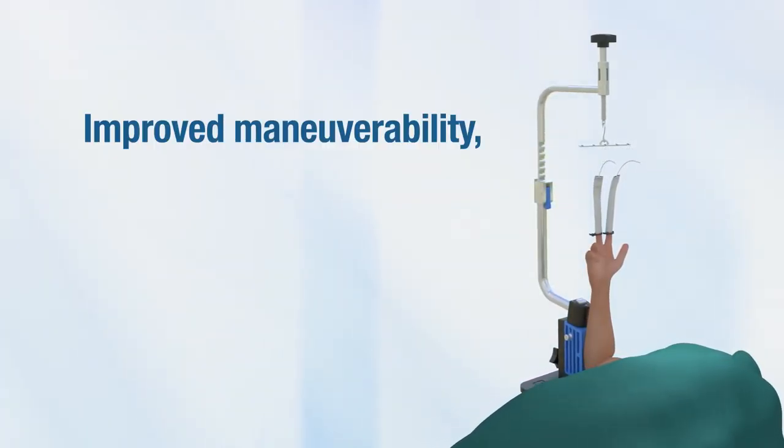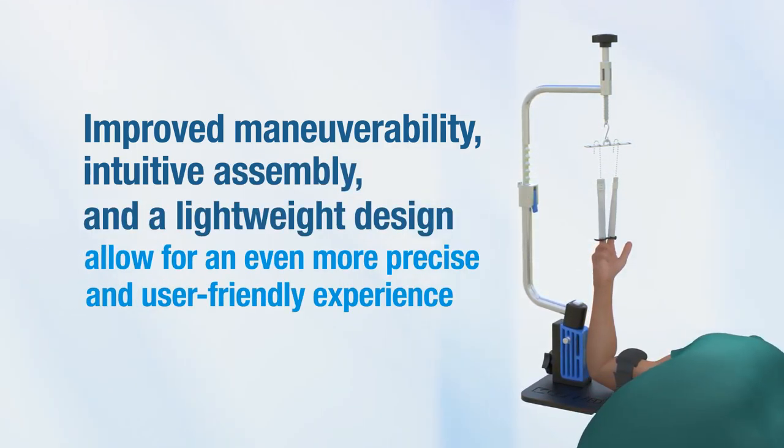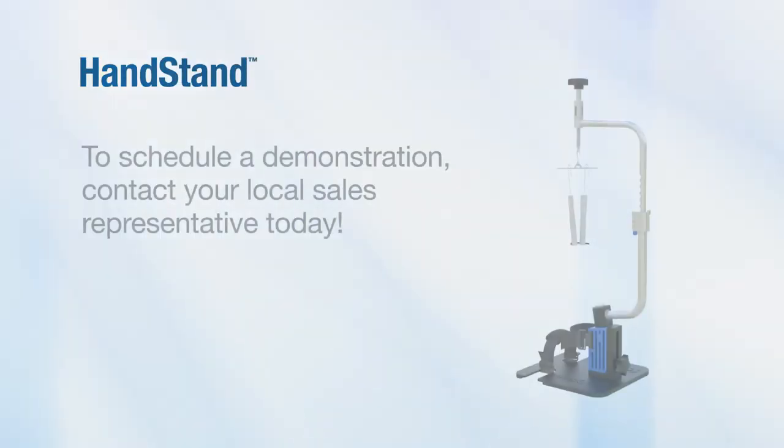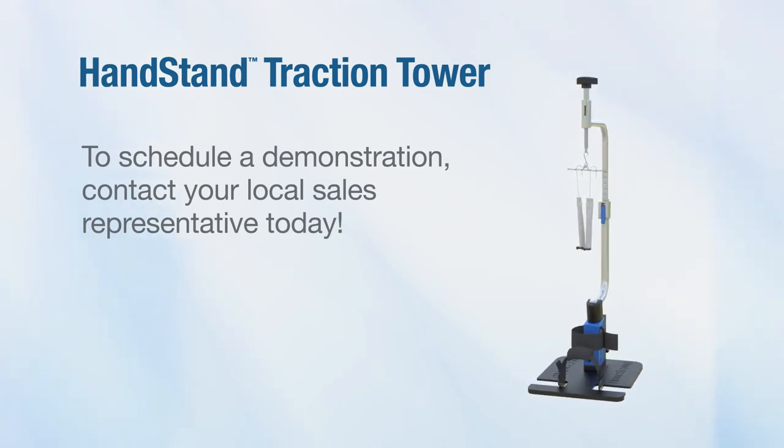Improved maneuverability, intuitive assembly, and a lightweight design allow for an even more precise and user-friendly experience. To schedule a demonstration, contact your local sales representative today.